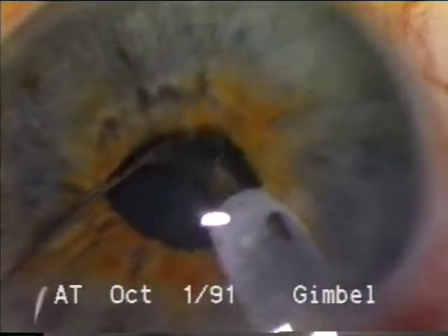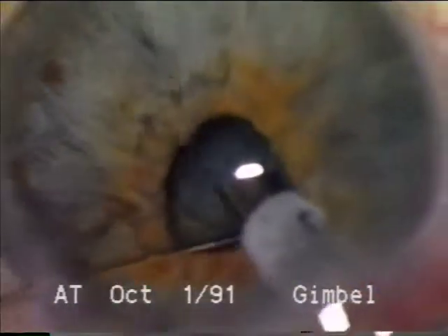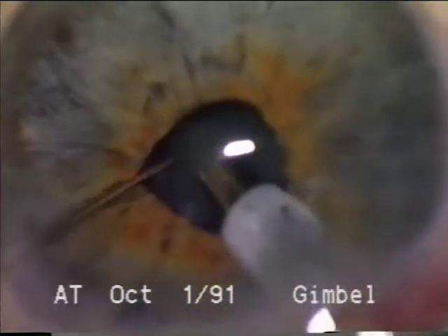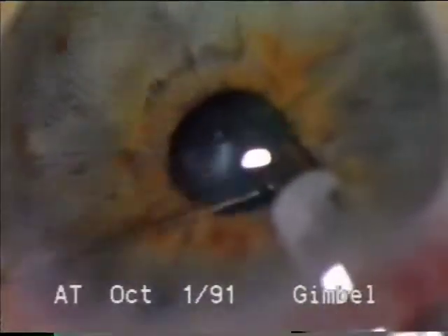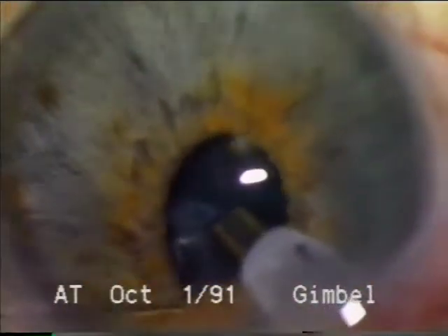I think this case illustrates that with experience, phacoemulsification can be accomplished without enlarging the pupil, except for those pupils that have fibrotic rings and cannot be distended with the instruments — and particularly cannot distend to allow the lens to be implanted through the small pupil. But this pupil will stretch. So it's factors of fibrosis and ring-like elements of the pupil that dictate whether the pupil should be enlarged, in my experience.